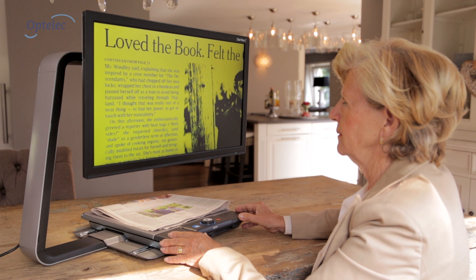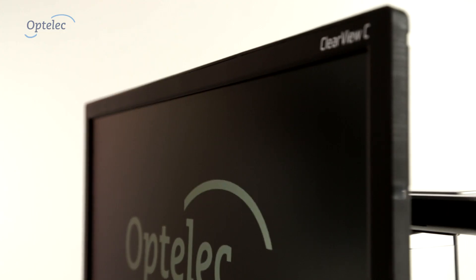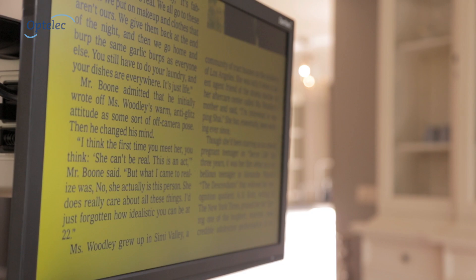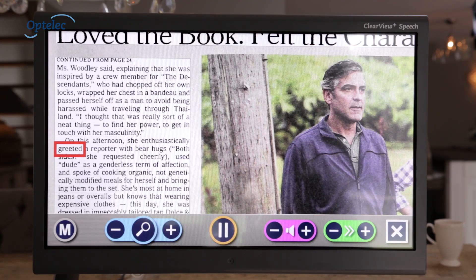Optelec introduces a brand new innovative video magnifier, the Optelec ClearView C. The Optelec ClearView C gives people with low vision optimal reading comfort. It magnifies text and images or reads text aloud.